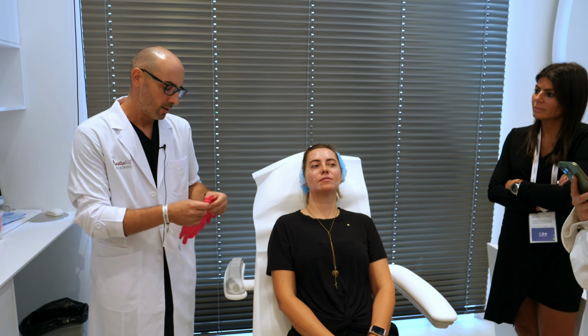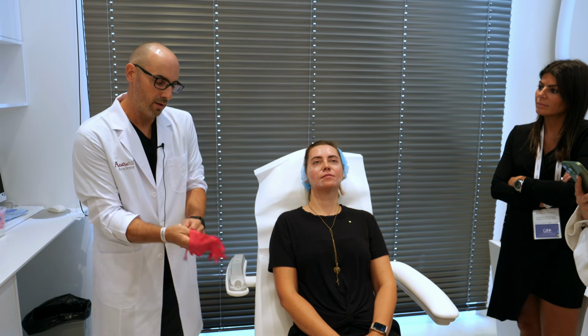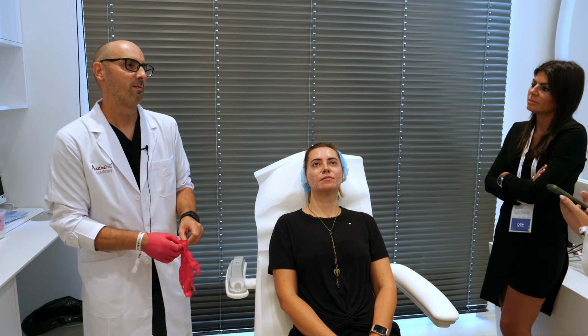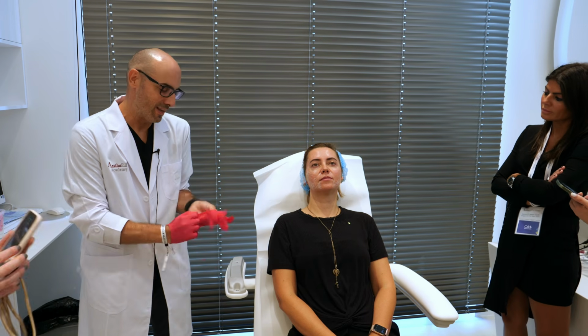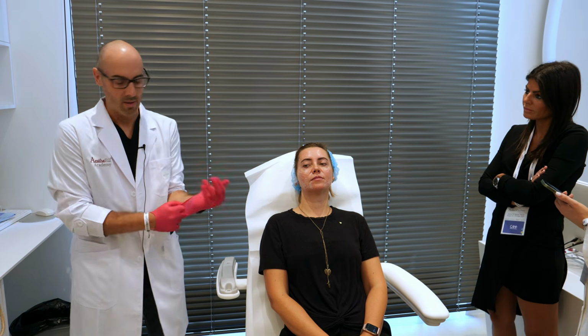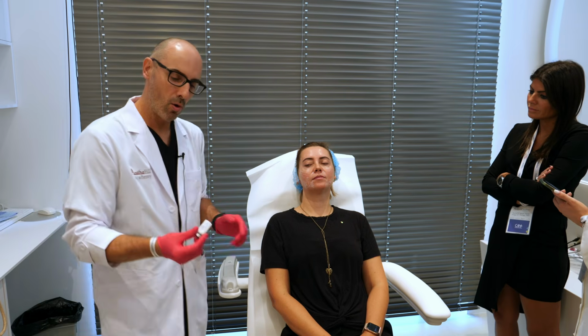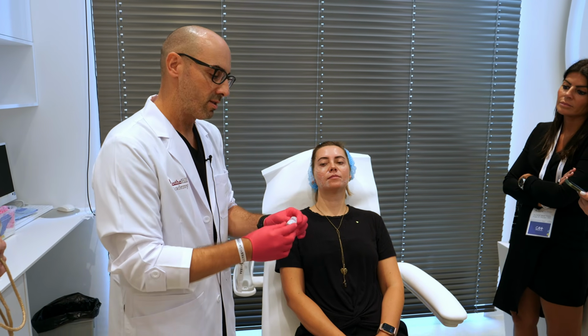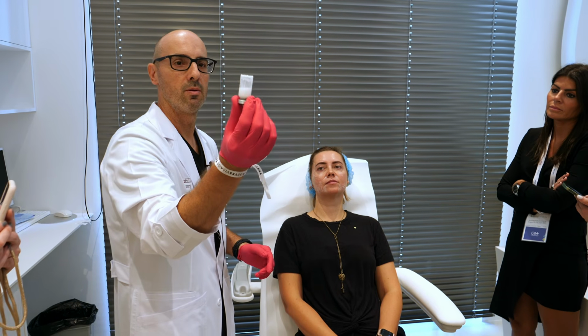First, we prepared this morning the vial of polylactic acid. Do you know that it is PDLLA, polylactic acid? And you can see, only with water for injection, it's a homogeneous solution.